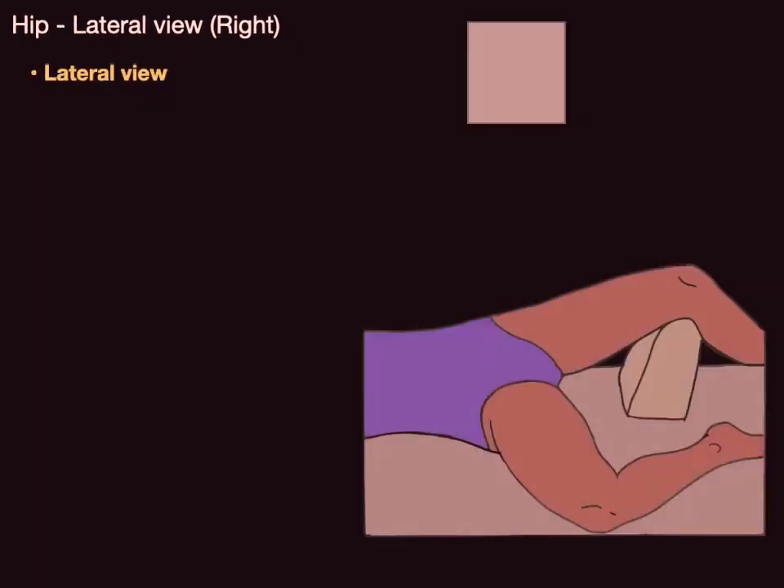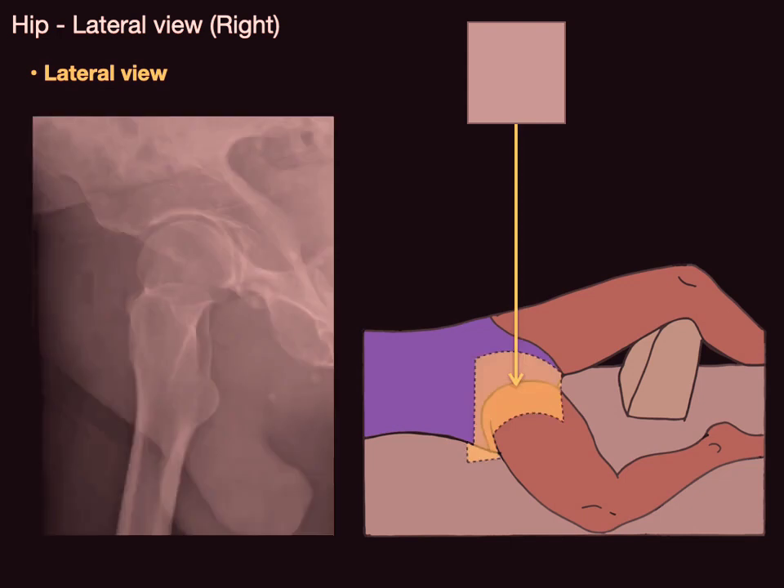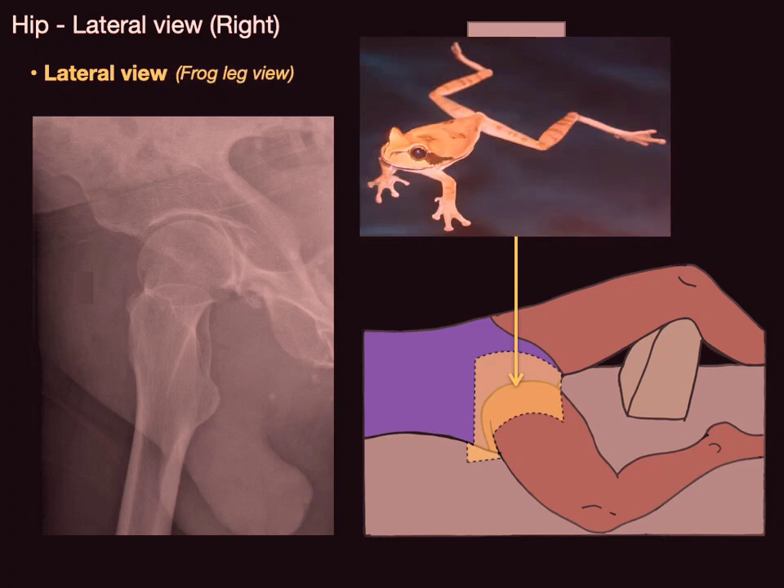Now let's look at the hip from a lateral view on the right side. The patient has their leg abducted and externally rotated, and the x-ray goes right onto the hip joint, forming an orthogonal view where the femur is at more of a right angle from how you usually see it. This lateral view is sometimes called the frog leg view.